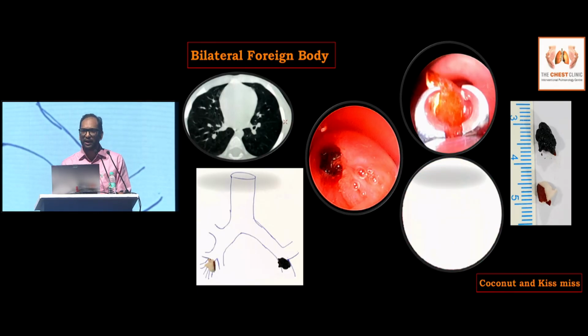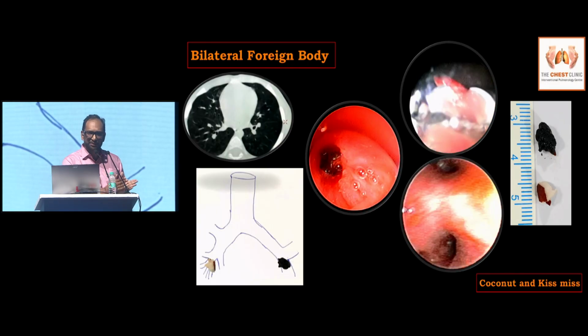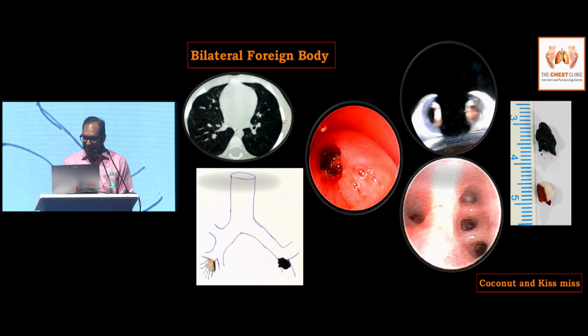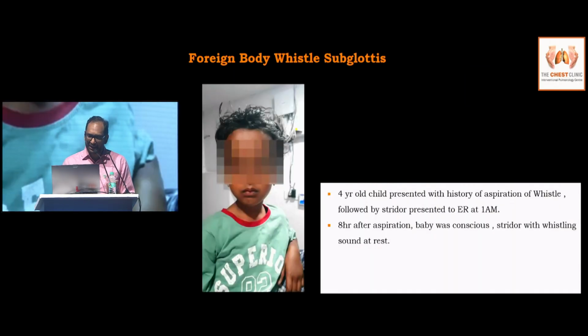I just want to highlight the use of both systems. Neither is superior to the other. If one fails, the other should be of help. So this is another interesting case.